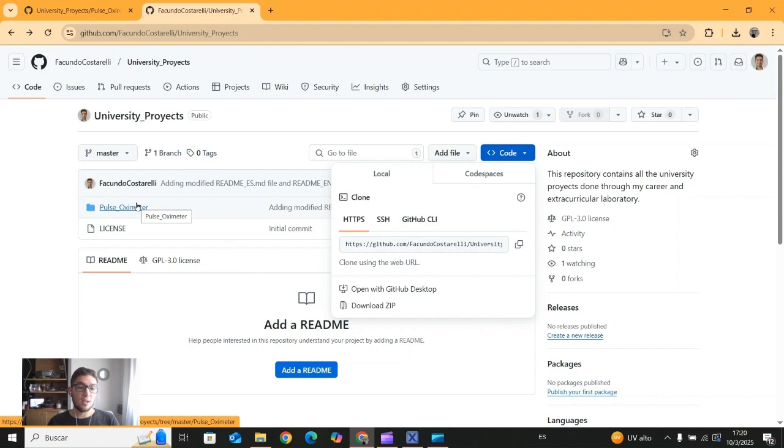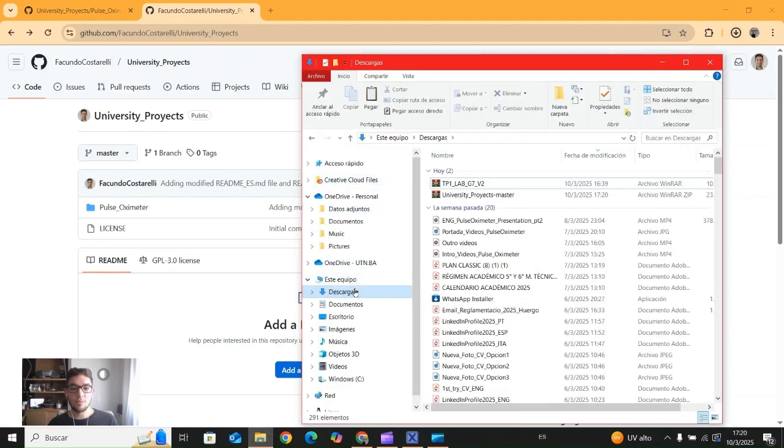As of today, we have just one project uploaded, which is the PulseOximeter project. Probably in the next few days, you're going to see more projects uploaded. So the only thing is to download the repository and then delete the other projects that you may not want. So we go to code, then download zip. Okay, now we go to the downloads section.